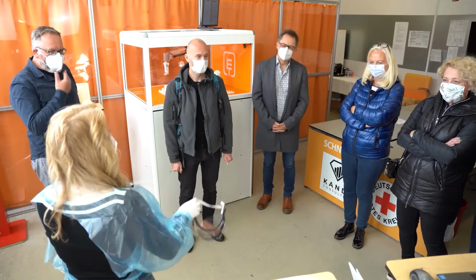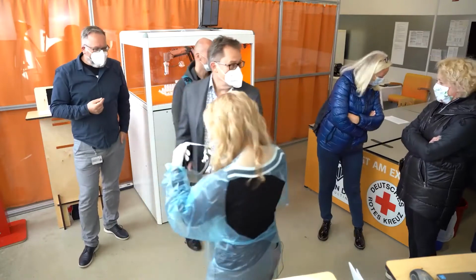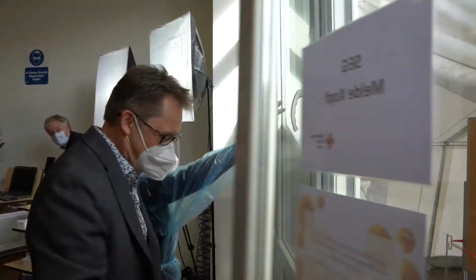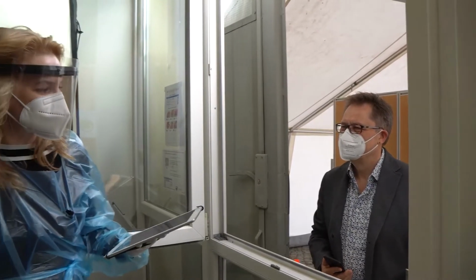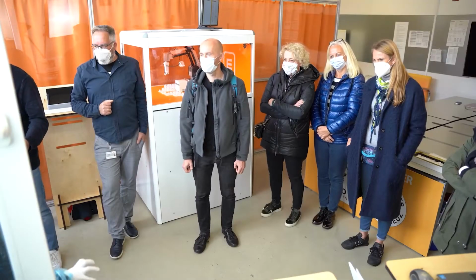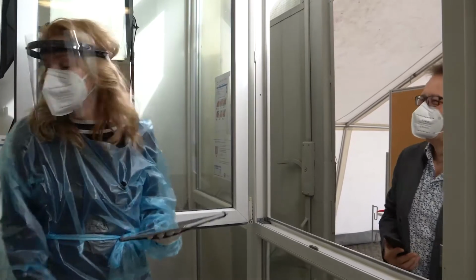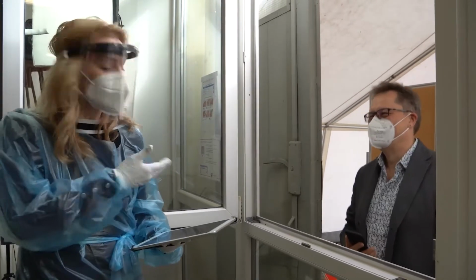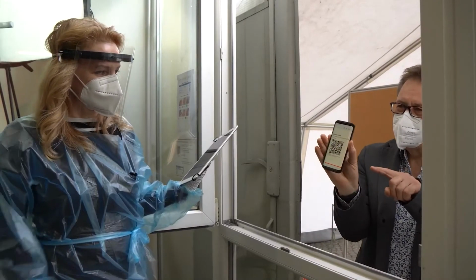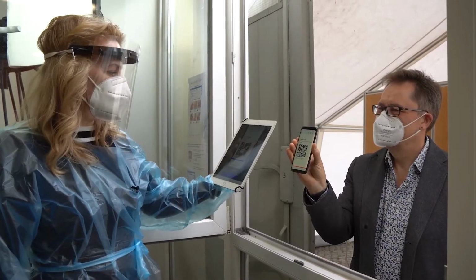And now I would like to test Mr. Uphoff. Do you have your QR code? So we have a customer now. First, Jens was at our website and he filled in a form to get a date with me today to make his test. Because he made a date with me, he got a special QR code, and all my personal data are encoded in this QR code. So I scan it.